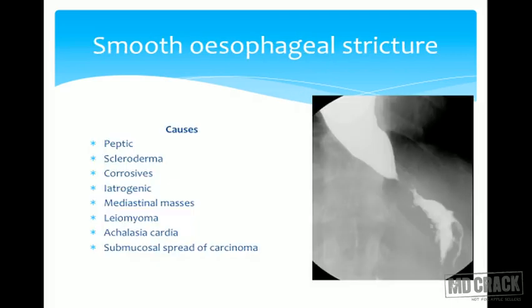So we go ahead. When we have to perform imaging of the hollow viscus, which would include your esophagus, your stomach, your jejunum, your small bowel, and your large bowel, there are predominantly 2 or 3 investigations. One is your barium studies. When you do only your esophagus, you have the barium swallow. When you're evaluating your esophagus, your stomach, and the duodenum, that is your barium meal.